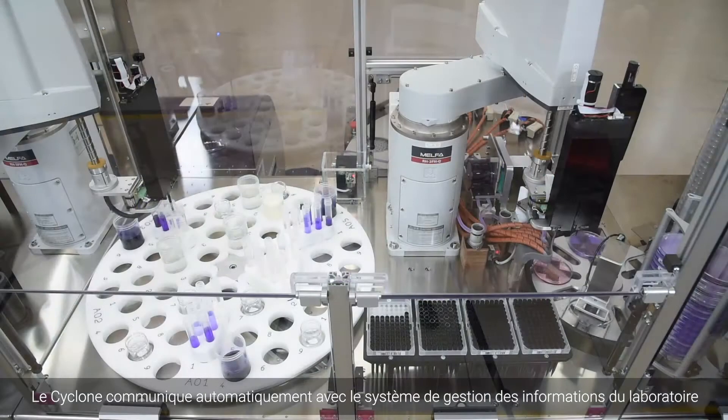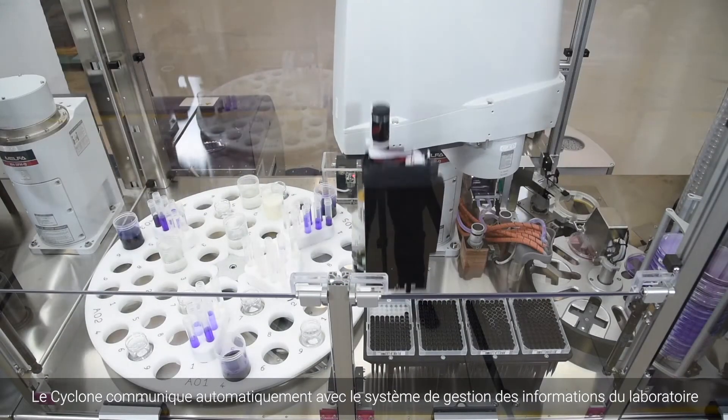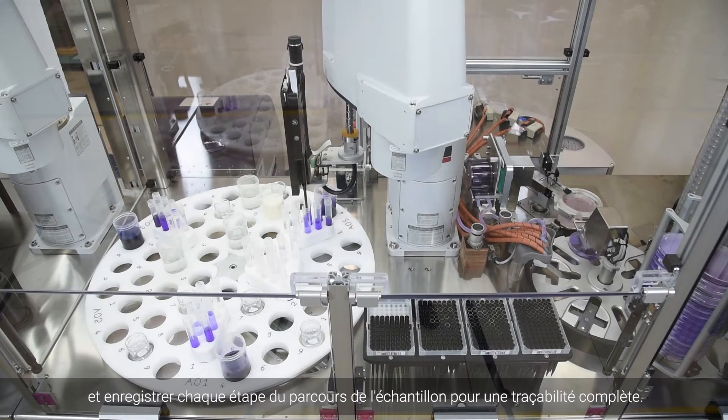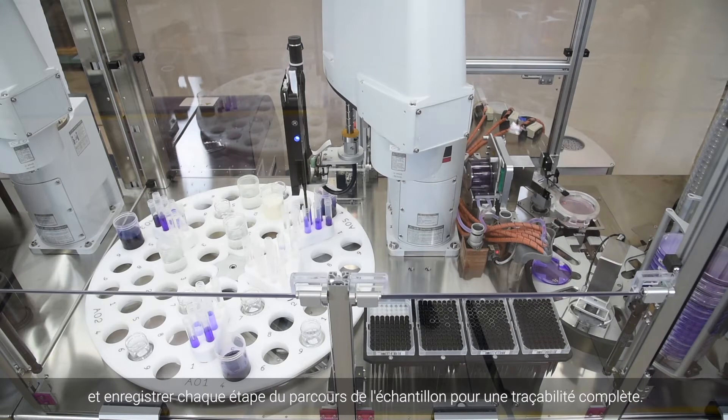The Cyclone automatically communicates with the laboratory's information system to identify the sample, determine protocol settings and record every step of the sample's journey for complete traceability.